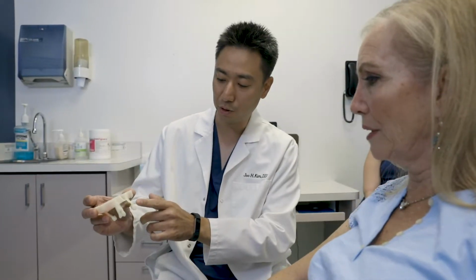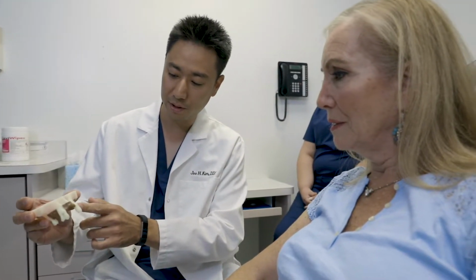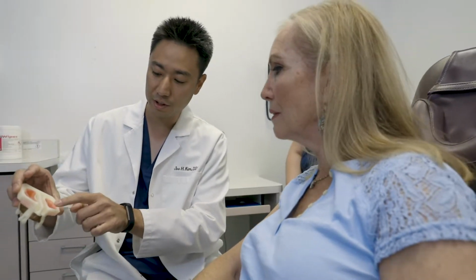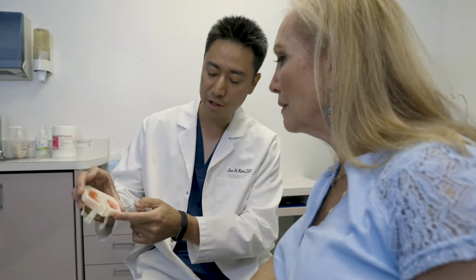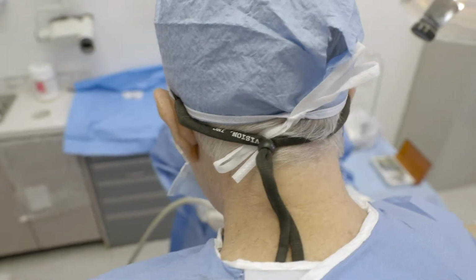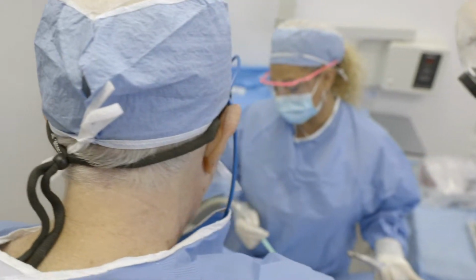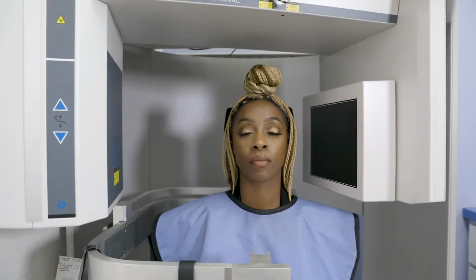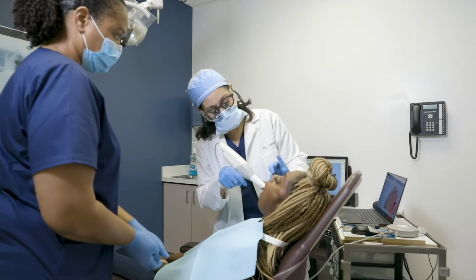To achieve long-term predictable results, any treatment options that we discuss with patients should start with a diagnosis, a correct one. So the first visit is to gather information with a thorough examination and consultation. We also obtain data such as three-dimensional imaging with CT scan, digital impression of the mouth, photos of the patient for smile evaluation and simulation. Once we have all our information, a proper treatment plan is generated with possible alternative options.